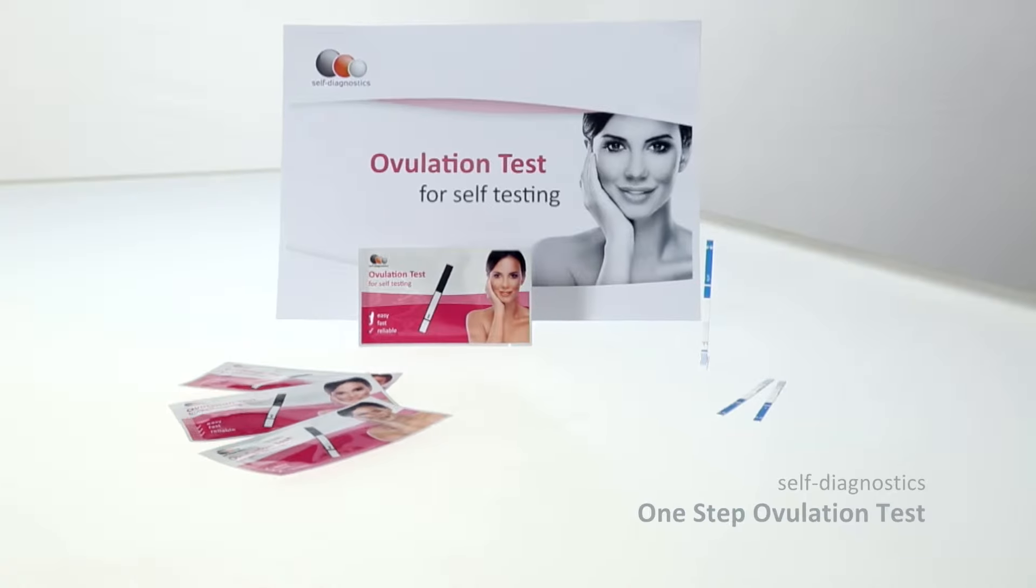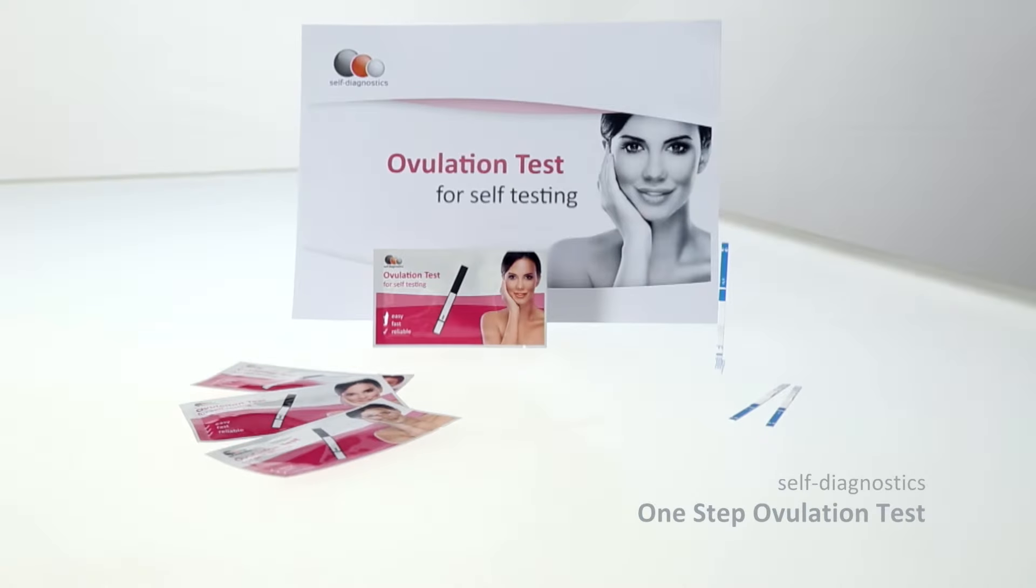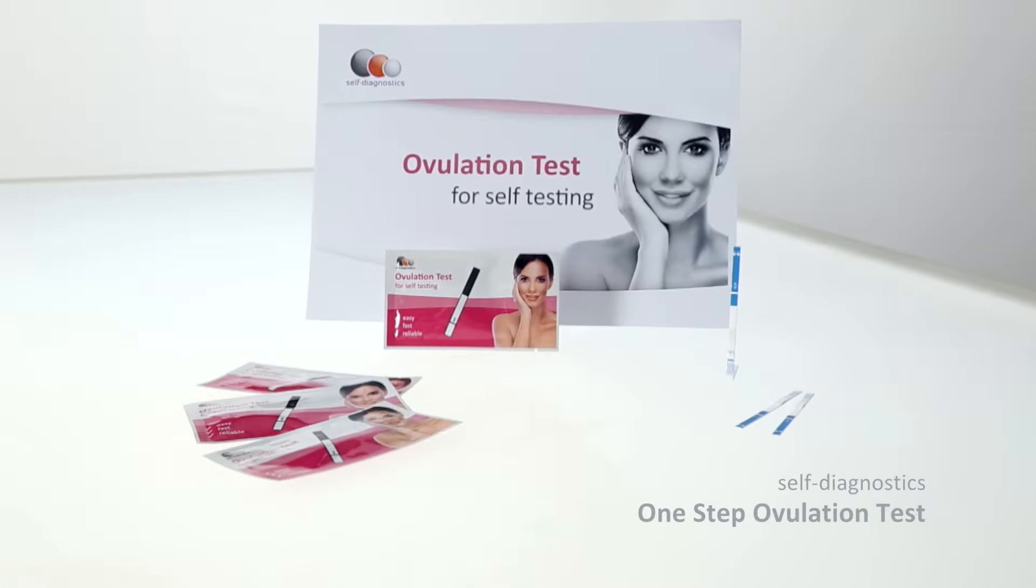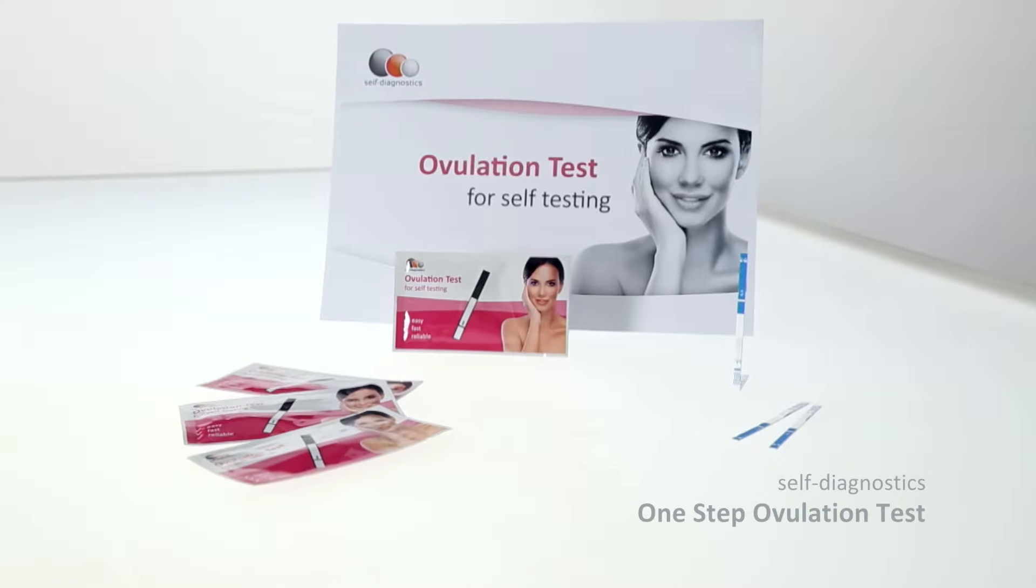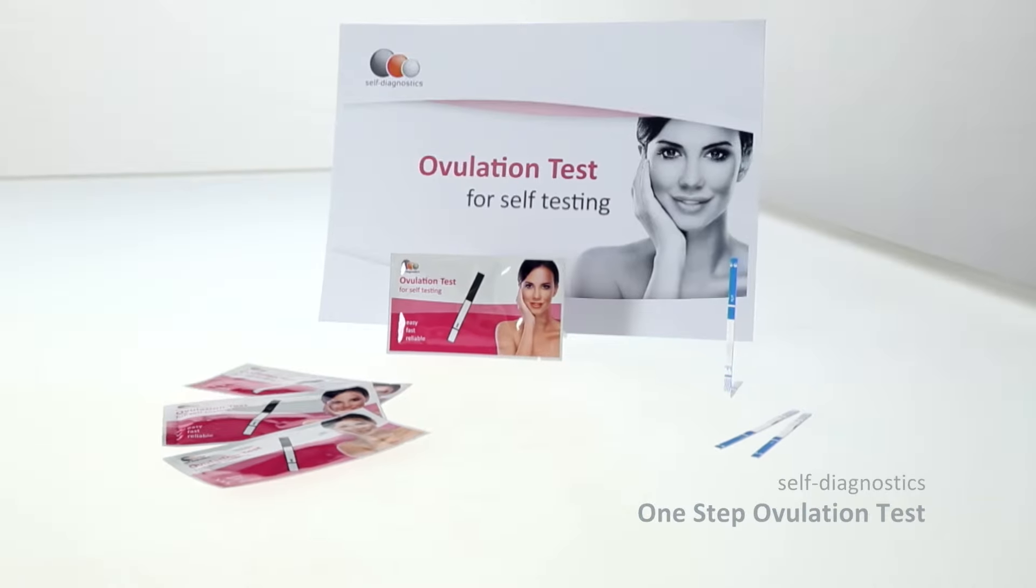The Self-Diagnostics One-Step Ovulation Test helps you determine the day you ovulate and thus the fertile days in your cycle. Because when it comes to family planning, the right timing is decisive.